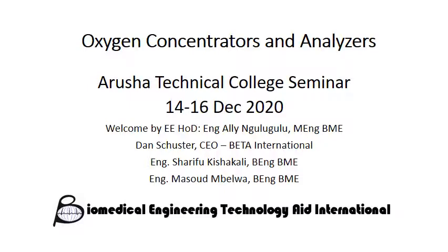Welcome to the second day of the oxygen therapy seminar for biomedical technicians at Arusha Technical College. This day we are devoting to oxygen concentrators and analyzers.